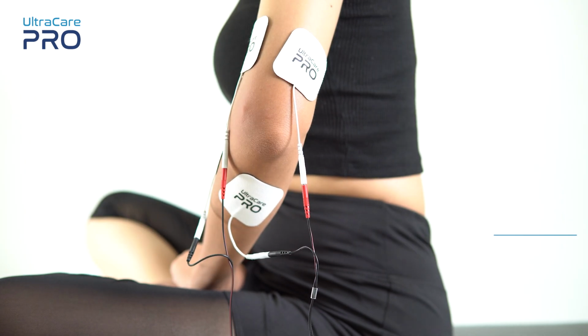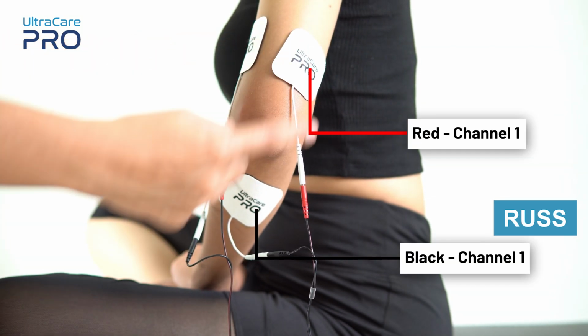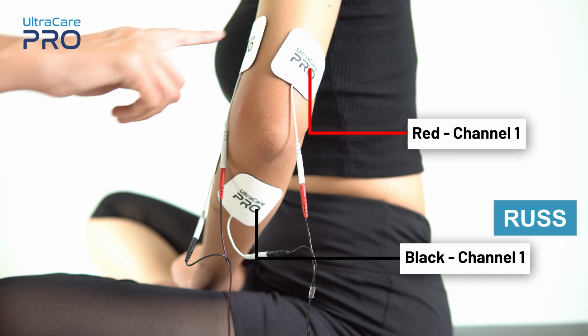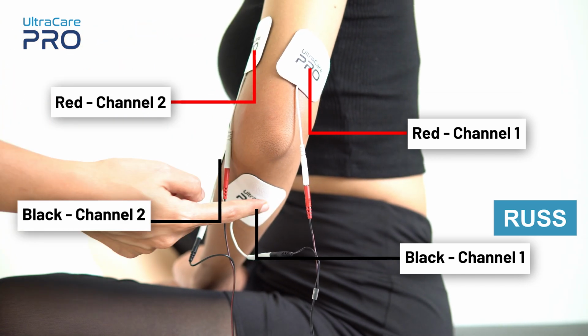For Russian current, place red and black electrode from channel 1 on one side of the elbow region. Similarly, place red and black electrode from channel 2 on other side of the elbow region over the muscle that needs to be stimulated.